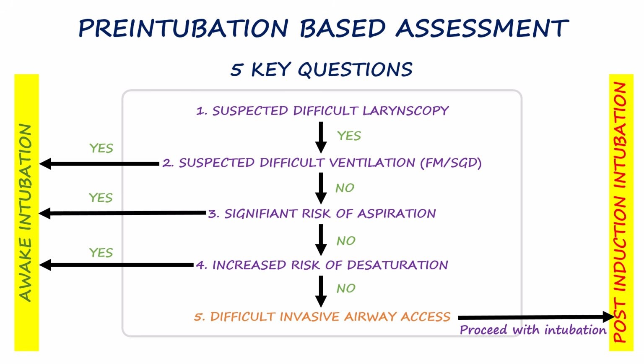If invasive airway access is deemed difficult, we must again consider awake intubation. Any single factor, or a combination of factors, may be significant enough to make awake intubation the safer option.